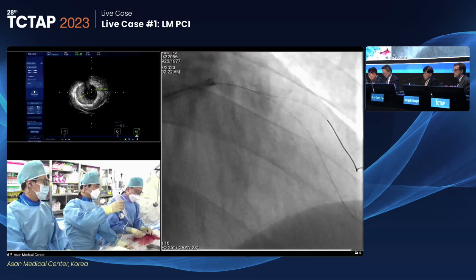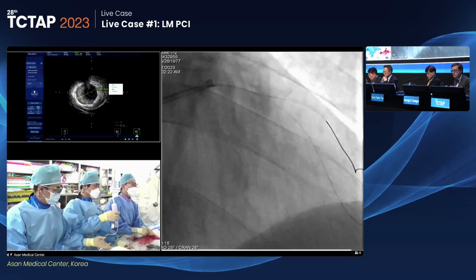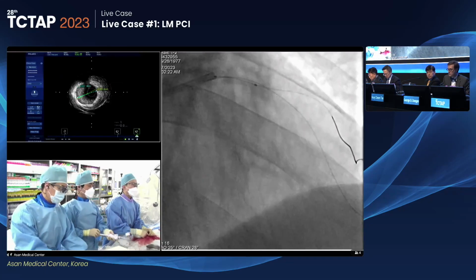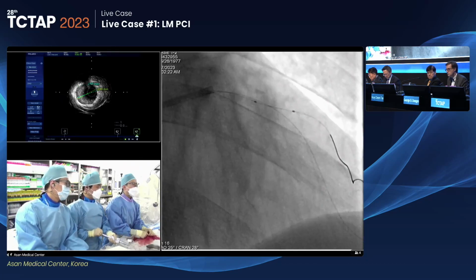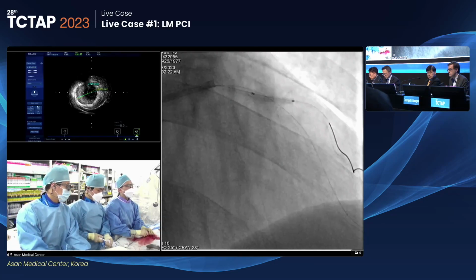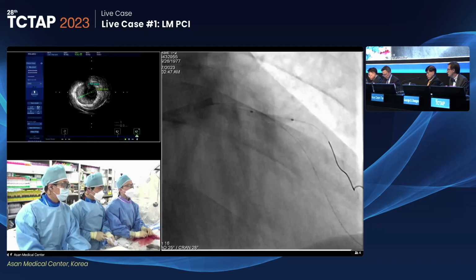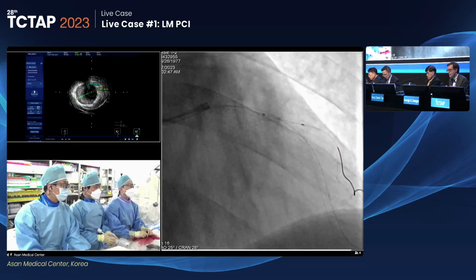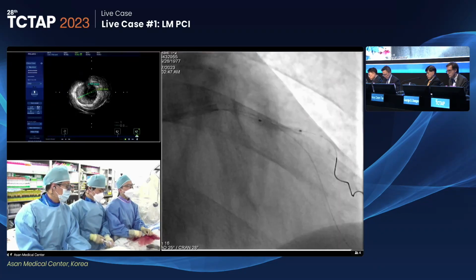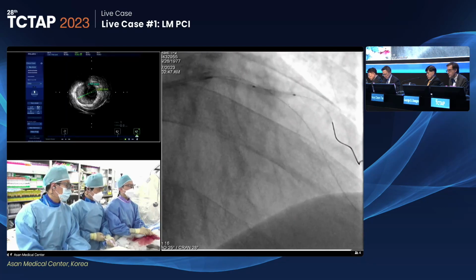This is 2.5 NC. I will apply NC balloon to diagonal ostium to further dilate. Because of the angle, there's severe resistance here. Okay. 12, 14, 16, 18, 20, 22, inflation. Okay. One more time, 20, 22, 24. Yeah. Let's see, hopefully things will deliver now.